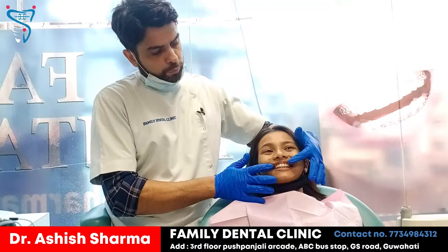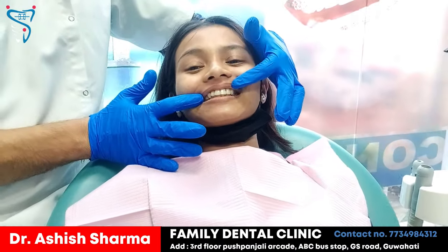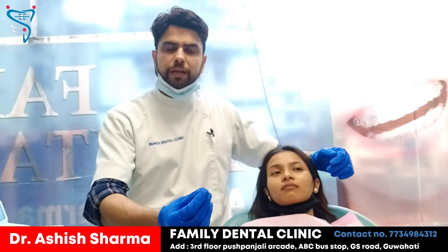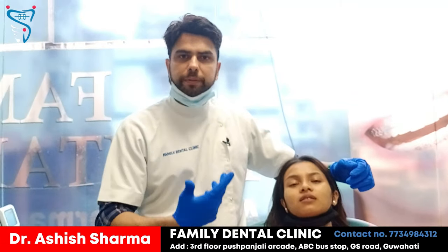These retainers have to be worn for at least one to one and a half years by this patient. They are very convenient to use. One more important thing — never brush them. Just wash them in tap water. When you wake up, take them out and wash them in tap water.